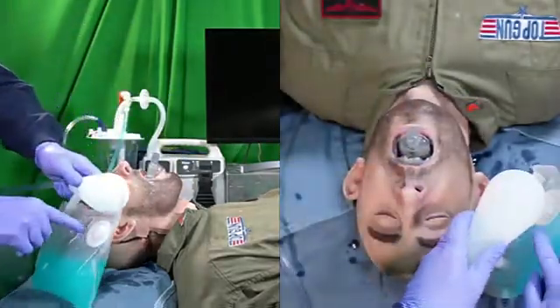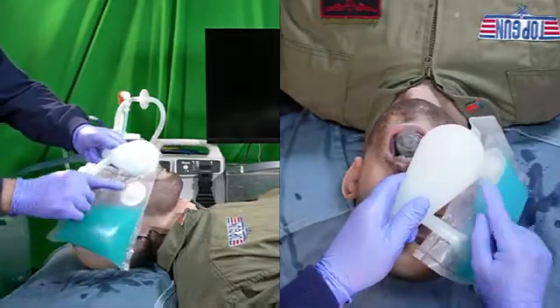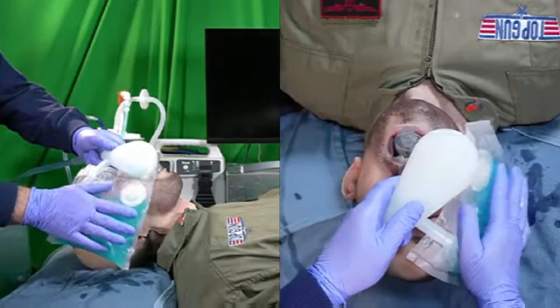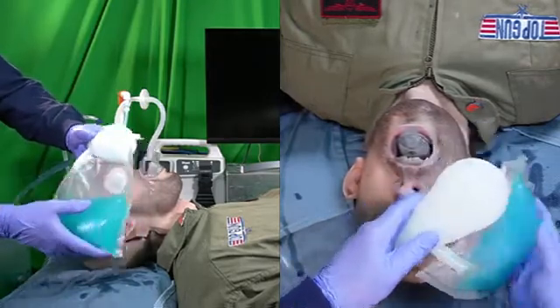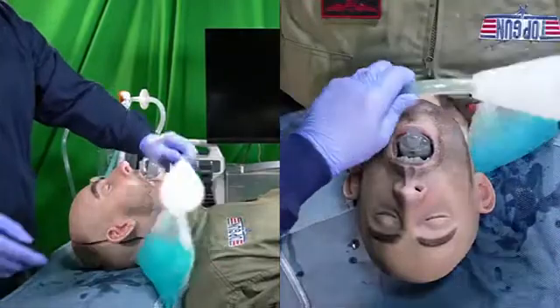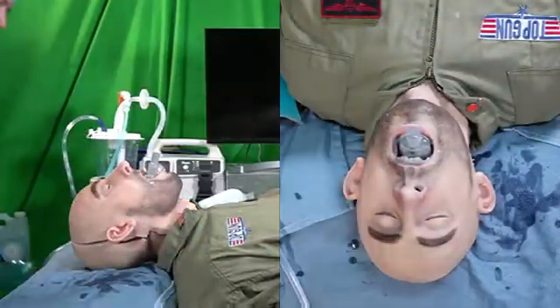This round hole allows us to burp air out of the device until the diaphragm that covers these holes becomes wet with airway contaminant. Now the device will not burp anymore, so it doesn't spray airway contaminant on the rescuers. The bag can hold up to a thousand milliliters of fluid. Here we have a patient that's been resuscitated and now we can ventilate him.